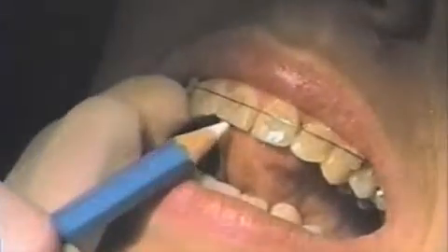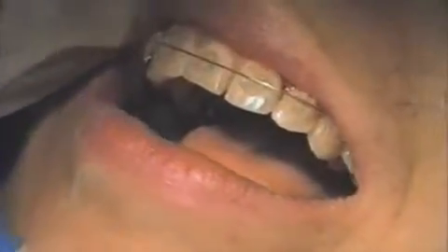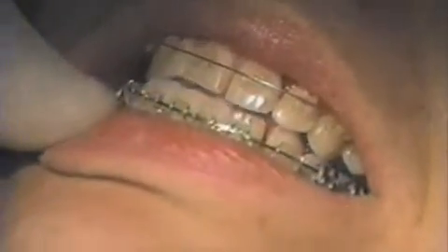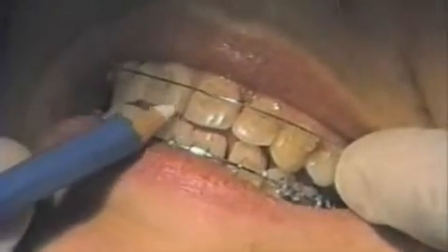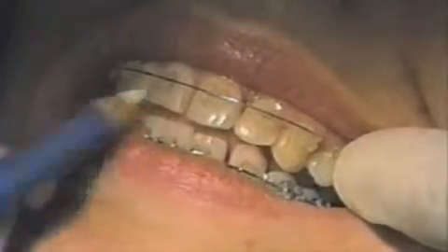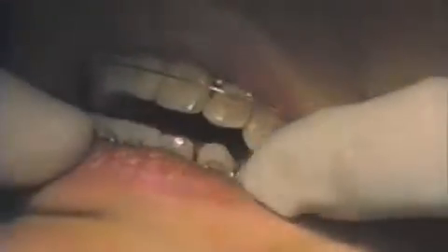On this patient, we would like to extrude the upper right central incisor. A space exists between the two central incisors — the space is larger at the incisal edge than it is at the gingival. This would indicate the necessity to tip the tooth, making the root go more distal. Otherwise, you will have the appearance of a space.